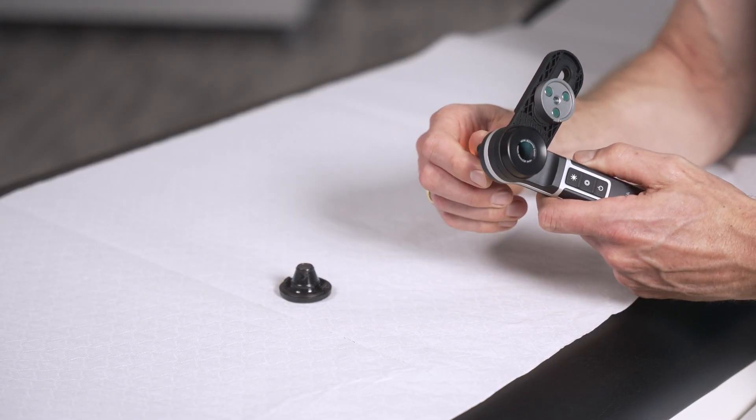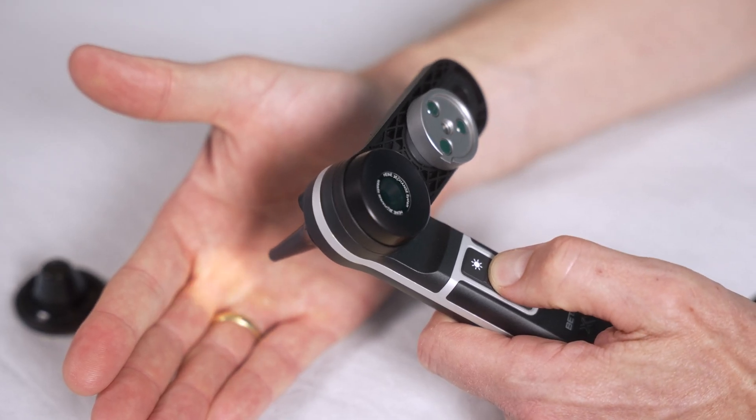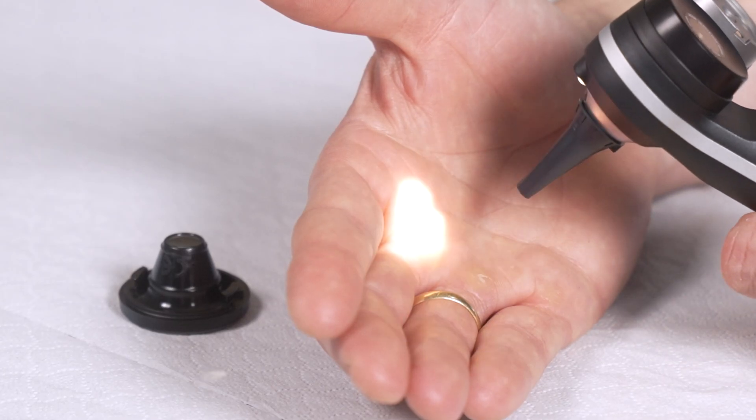Place a tip on the otoscope — select a tip size that works best for your patient. Switch on the otoscope illumination with the middle button and check which of the two light intensities you prefer.